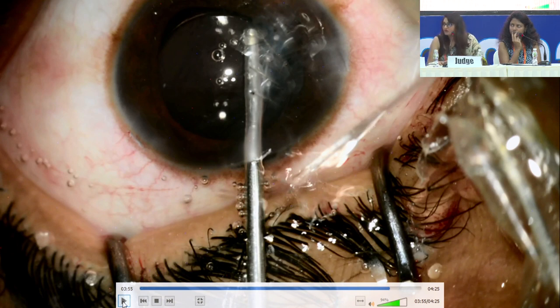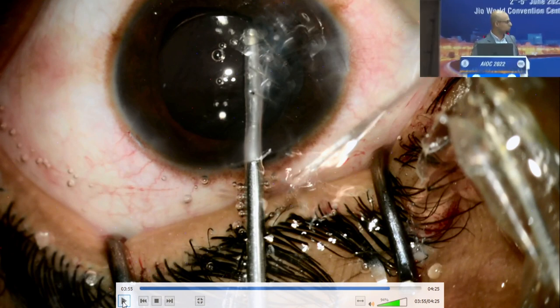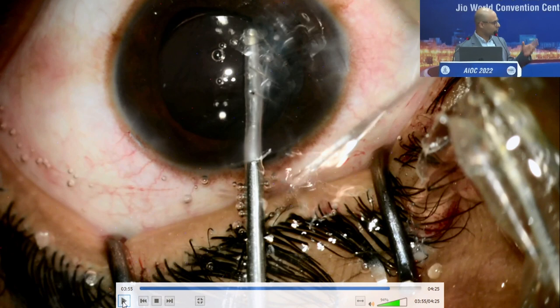So Sheetal, what happens is, even though your astigmatism is changing, your spherical equivalent doesn't really change much. I saw the topography on this case preoperatively and the central cornea was fairly okay. That's why I decided to go ahead, because otherwise you have to take the patient up for another surgery if that's avoidable. It's not like the lens is going to cause additional inflammation. So I took a call and explained to the patient that we may not get spot on, but he preferred the one surgery approach.